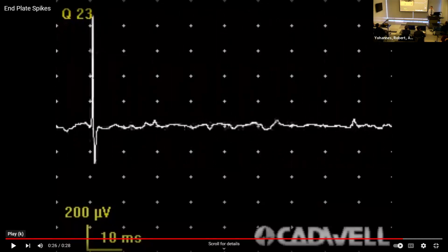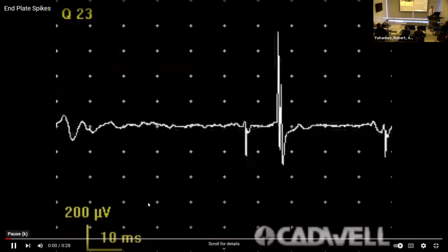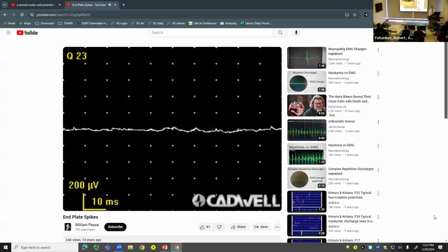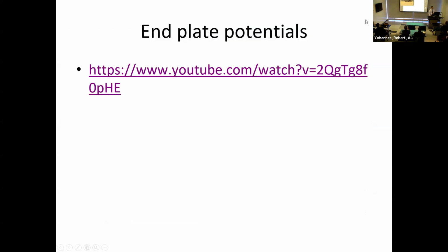They're very, very sharp. Later on, we'll go back to the normal unit. You already heard the normal motor unit. It had a lower frequency. In this case, it's much sharper, and in the background it's more like an airplane, some humming in the background.